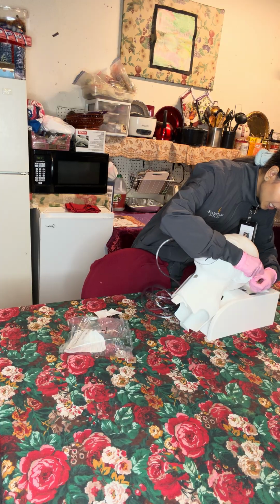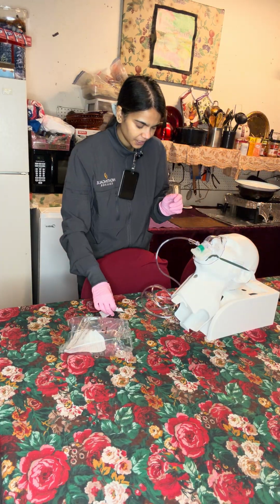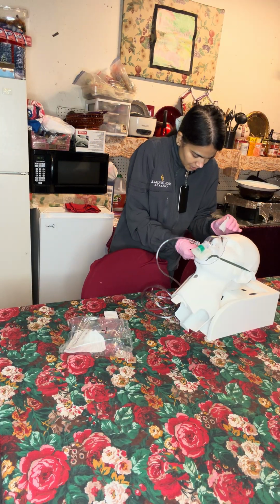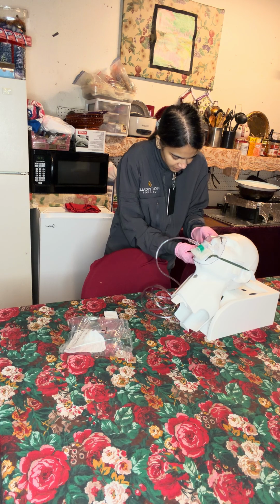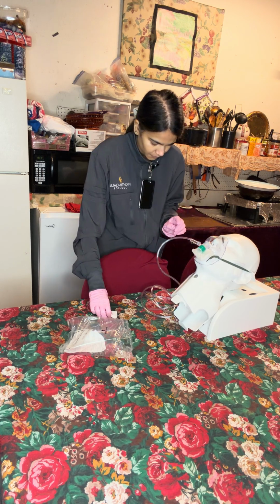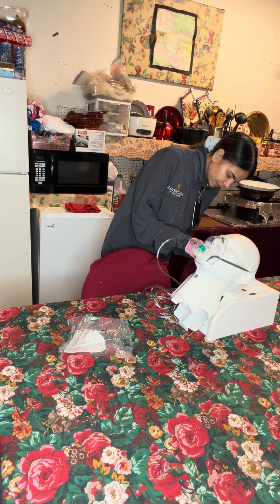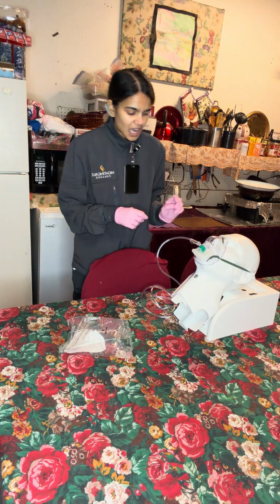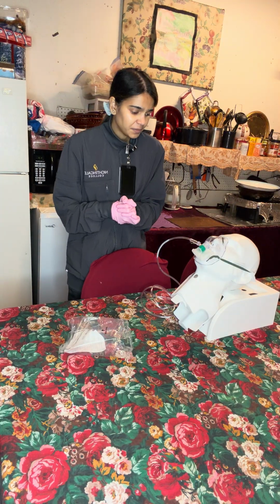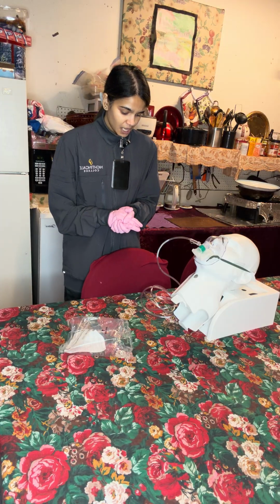Those who wear oxygen therapy devices do experience friction and redness to the skin as the oxygen tubings are on for longer periods of time. Once the gauze has been applied, we'll check again every 4 hours to make sure that the patient does not have any skin irritation, redness, or skin breakdown.